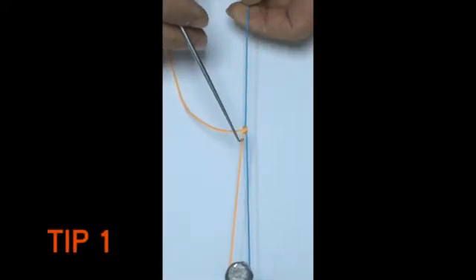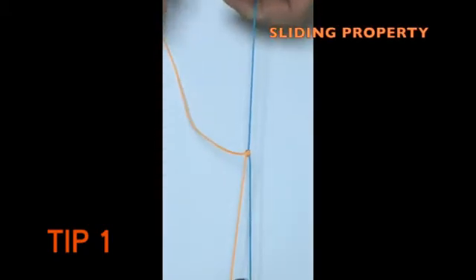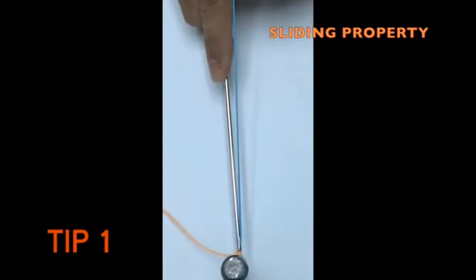Any configuration of knot will retain its sliding property if the post limb is gripped under tension and in a straight line.